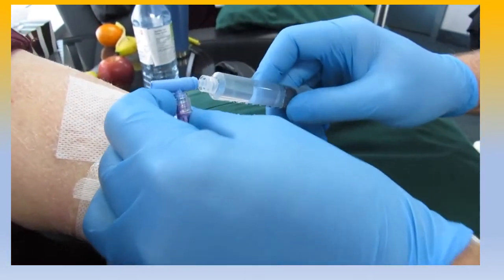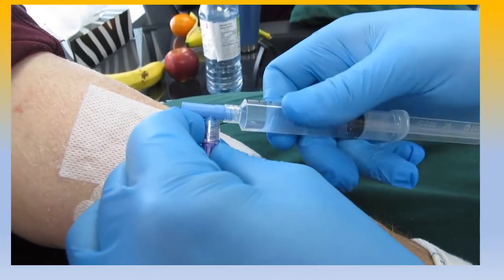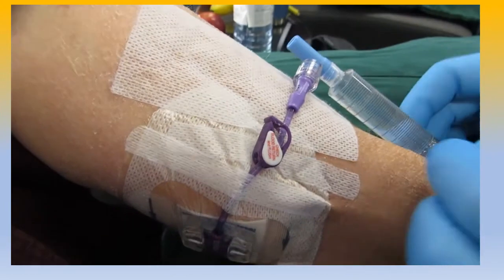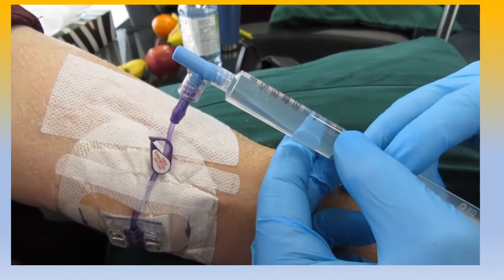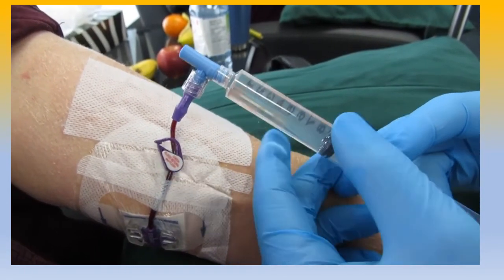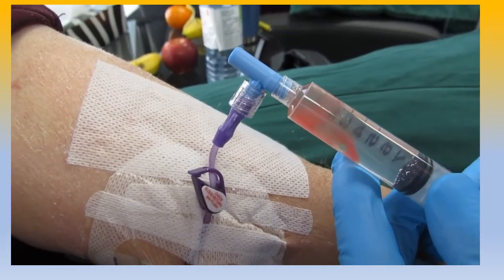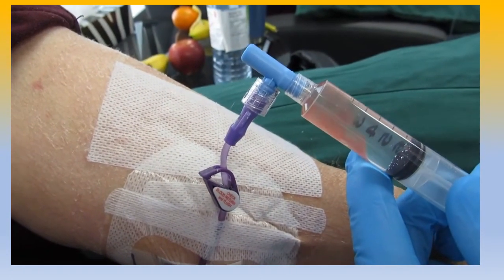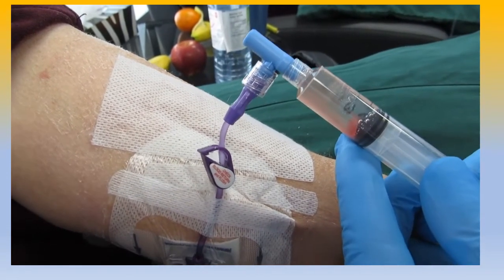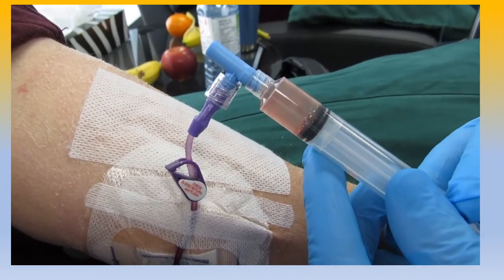Again, like the port, essentially it's a 10 ml syringe filled with normal saline. Luer lock tip. And of course, opening the clamp. First thing we do is advance it a little bit, and then we pull back, make sure we have blood draw back. You want to see the blood flow, and then we have to prime it a few times. So back and forth, just cleaning the whole port, or sort of PICC in this case. Back and forth.